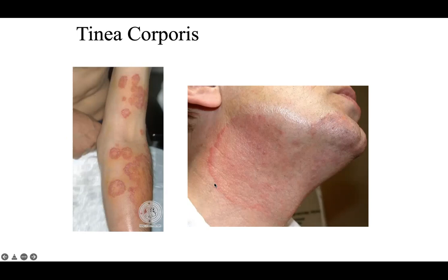The good thing too is if you see spongiotic dermatitis and you see that reaction pattern, you'll immediately know it's not granuloma annulare, since you don't have a proliferation of histiocytes in the dermis, palisading around necrobiotic collagen. So we'll get to that lecture here as well.